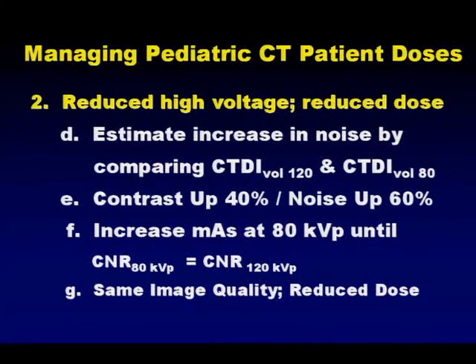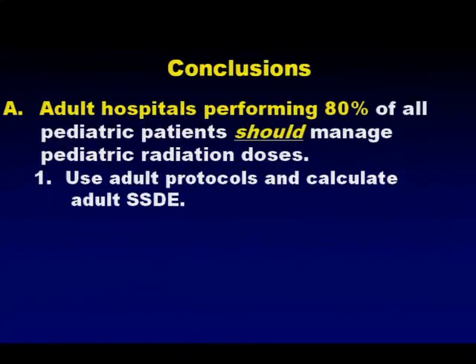Okay, as a consultant, you obviously don't have a lot of time to invest in these kinds of activities for most of your clients because they're not willing to pay for the service. So grab the low-hanging fruit. Try to make sure that the adult institutions doing kids occasionally are delivering doses equal to or less than the doses that they're delivering to their adults.